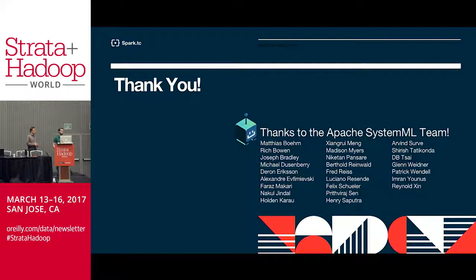Yeah, so it's a great question, right? And that's where the domain knowledge comes into play. From a medical practice standpoint, you're going to biopsy a tumor, so you're already assuming that the tissue is a tumor. However, you certainly could accidentally grab some tissue outside of the tumor, and for some types of cancers there will be pockets or regions that are more expressive of the tumor. So that's always a concern, for sure. You hope that there's enough tumor tissue overall from the slide to normalize over any other regions. But it's an excellent question.